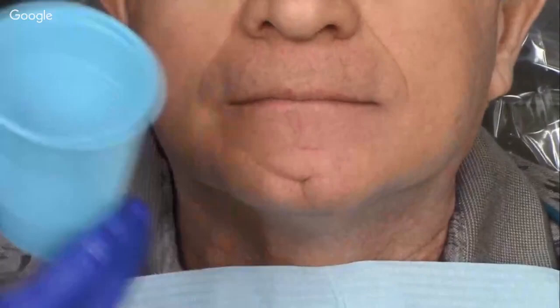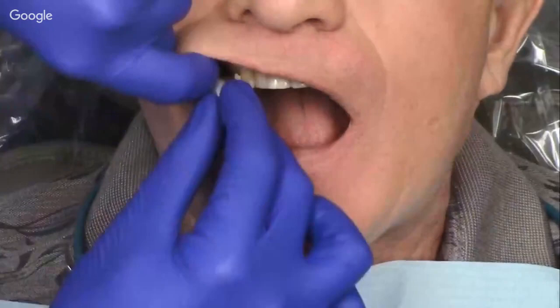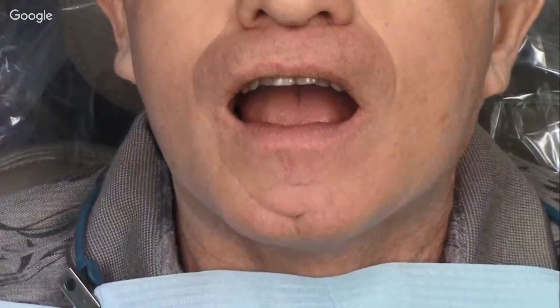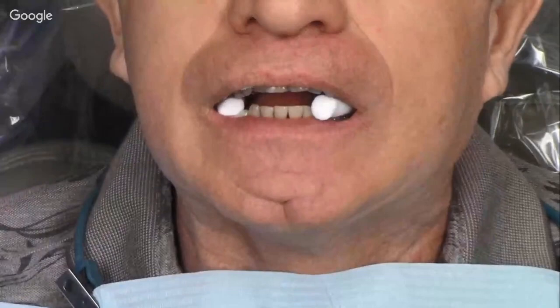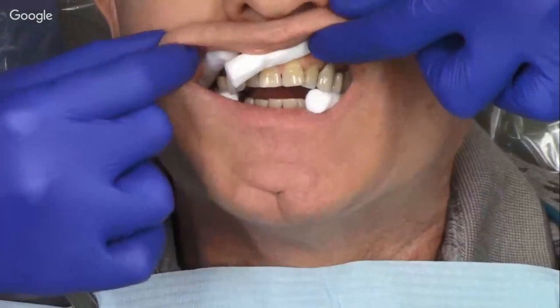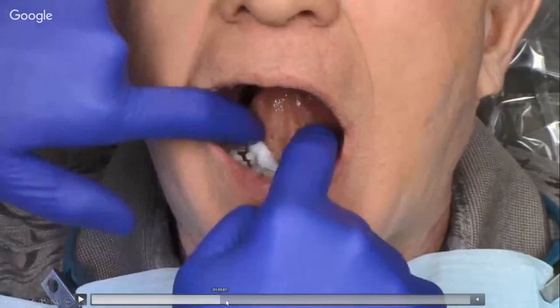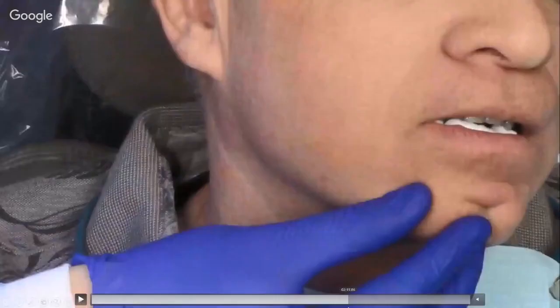To set up the patient, I take a series of cotton rolls and pack them in on the buccal and lingual. You can see my patient is heavily restored — this patient had crown-and-bridge dentistry from 1965 done at USC. This happens to be my father-in-law, so we keep an eye on his teeth. He's a classic type of patient where you'd have challenges making a cone beam scan and overlaying multiple scans. For a maxillary scan, all I need is three cotton rolls on the buccal, two on the occlusal, and the patient is ready for cone beam imaging. For a mandibular scan, three on the buccal and two on the lingual keeps the tongue away. For upper and lower together, I combine cotton rolls for both arches.